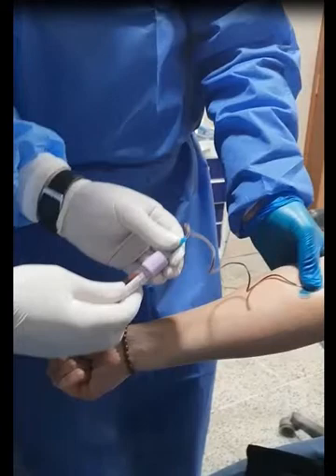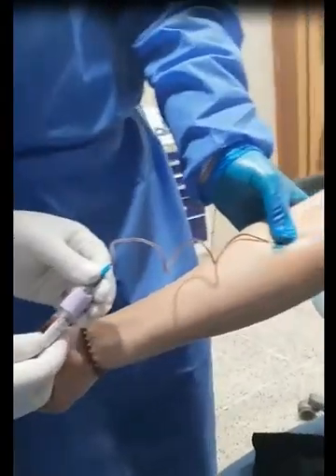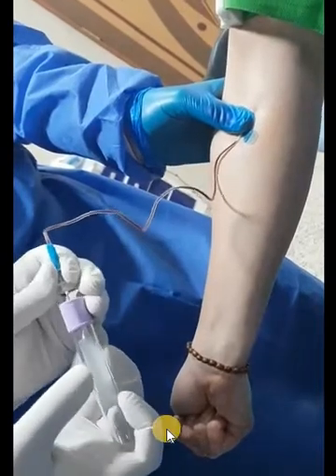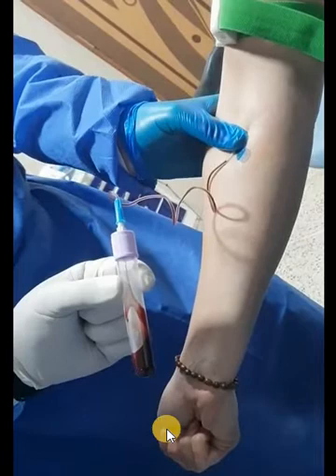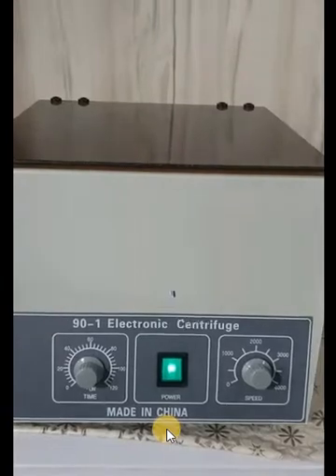So I tried to do a bone augmentation with PRF — platelet-rich fibrin — to perform the regeneration process. We started by taking the patient's own blood. I thought that I needed three tubes or three membranes for covering the area of the defect. We take this blood and centrifuge it for 10 to 15 minutes according to the speed of the centrifuge.